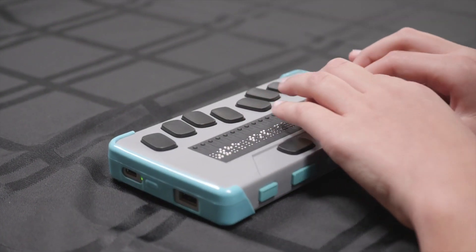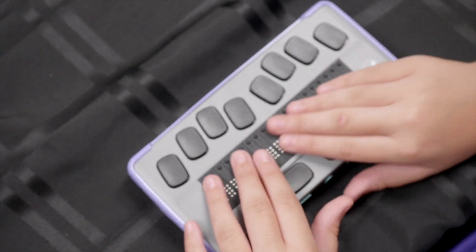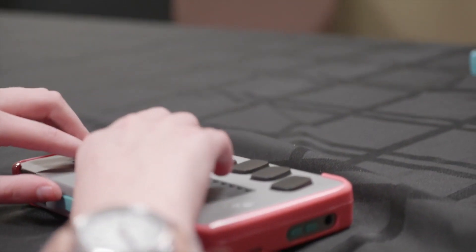The Chameleon 20 is a small portable 20-cell Braille display designed with the student in mind. The portability of the Chameleon is fantastic. The fact that you have 20 cells of Braille is great for ensuring that the student is getting enough Braille for efficient Braille literacy.